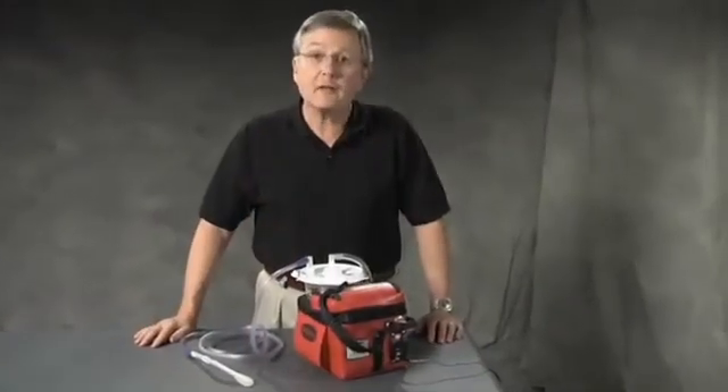In addition to all of these solid features, the Escort 3 is very economical to purchase and operate. It utilizes standard canisters and battery replacements are very inexpensive.